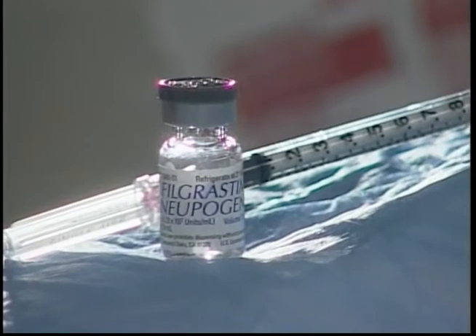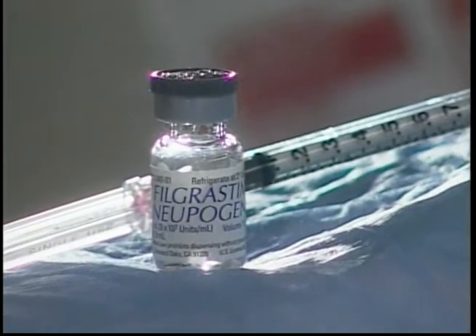Dr. Klein, if there are not enough of these stem cells to replenish my blood, then we'll have to do a bone marrow transplant, right? That's the crux of the procedure. We've developed a hormone-like drug that acts on your bone marrow so that it releases many more of these stem cells than it ordinarily does. So many, in fact, that there are high concentrations circulating in your peripheral blood. This hormone, or growth factor, works to directly stimulate your bone marrow. It works for both patients like you who are collecting their own blood, or for other donors as well. So what's the next step in the process? The next part of the video should make this more clear.